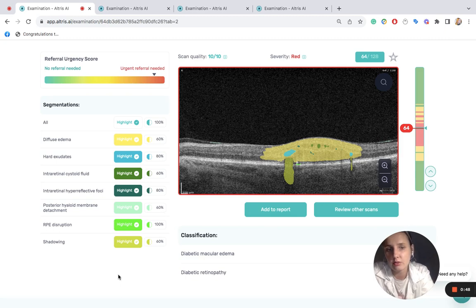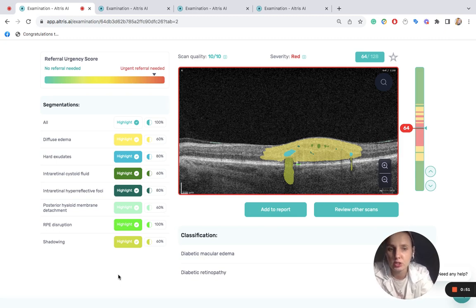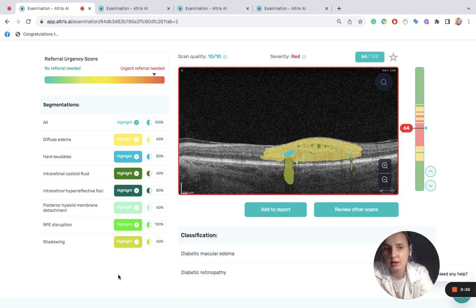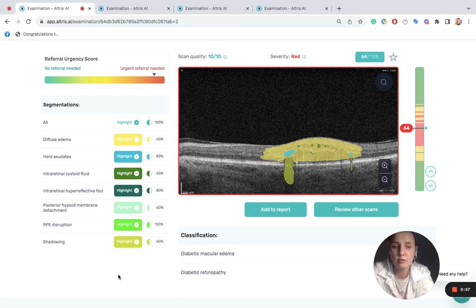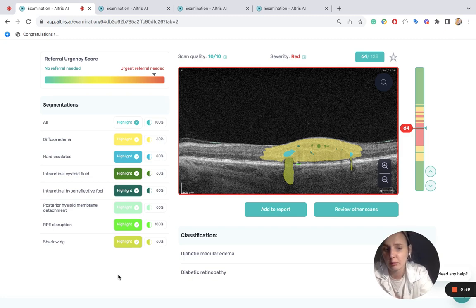More than that, these images can be compared with previous images to assess the development of diabetic changes in the eye and also to analyze the effectiveness of the treatment prescribed.